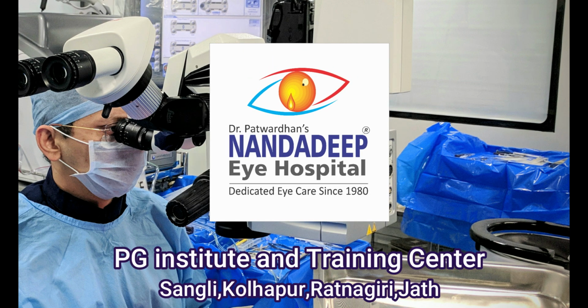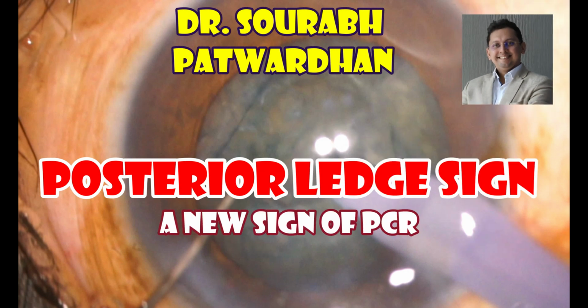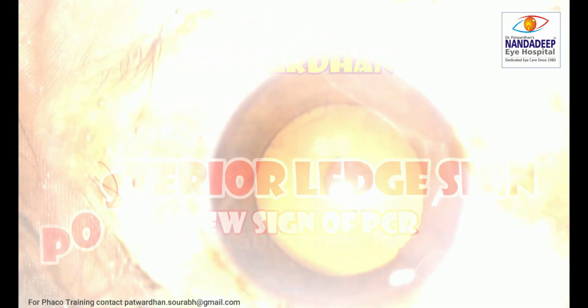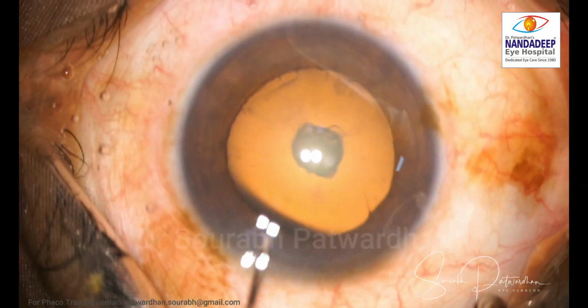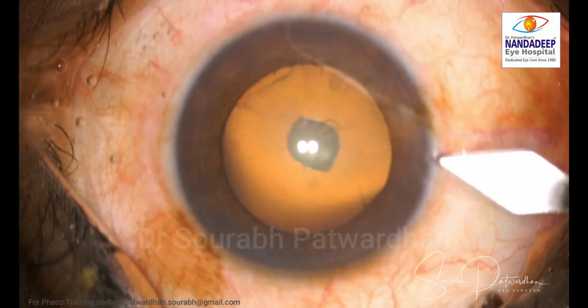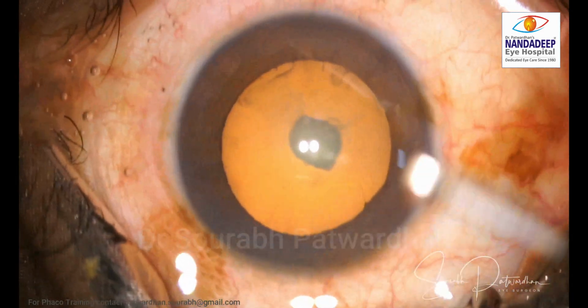Hello friends, I am Dr. Sourabh Patwardhan from Nandadeep Eye Hospital and PG Training Institute, and in this video I will be speaking about a new sign of posterior capsular rupture. I call it posterior ledge sign. Recognition of this sign early during the intraoperative course will help my colleagues in managing the posterior capsular rupture better. So this is a cataract.